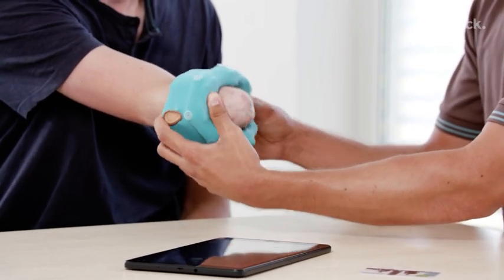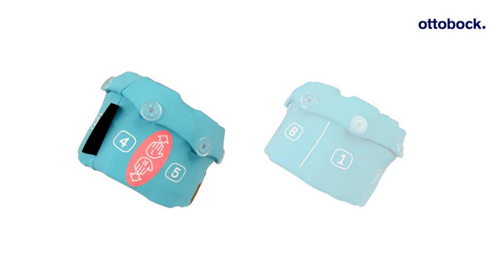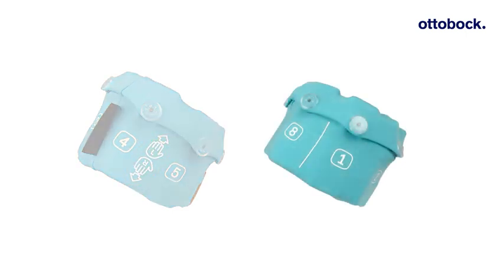The textile has been revised to support easier application of the Myo Cuff. There are now two hand symbols printed on the textile to clarify the application of the cuff on the right or left arm. In addition, a marking for the direction of the ulna and the electrode numbers from 1 to 8 were printed on the textile.